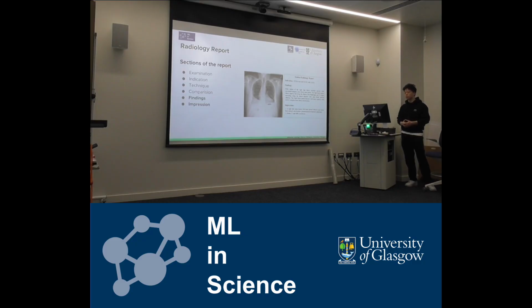The findings section contains key observations from the radiologist, while the impression section is a summary of the doctor's conclusion or recommendation to the patient. Additionally, there are other sections like indication, which just provides some patient history, but it's not our model's focus. Our model focuses on the findings section and also the impression section.